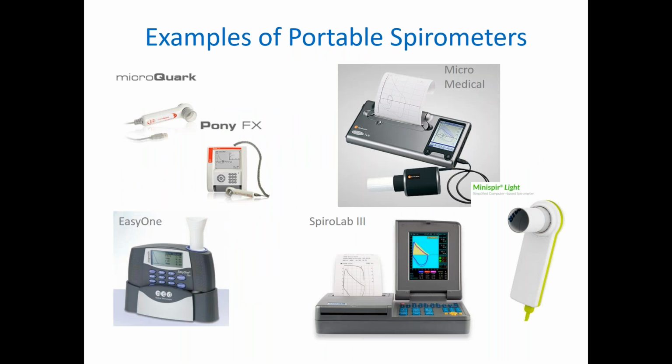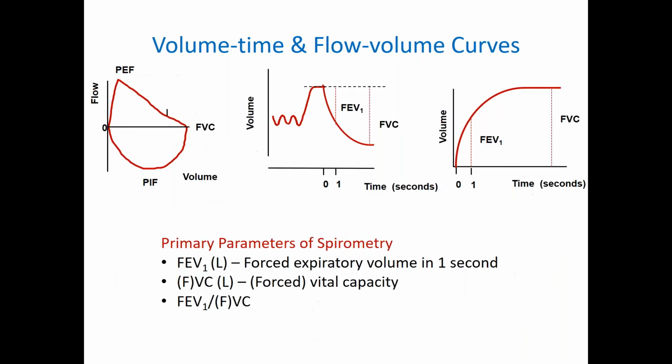On the screen, you'll see a number of examples of portable spirometers that you might find in primary care. We probably use more complex machines that also measure other aspects of lung function in complex lung function labs.